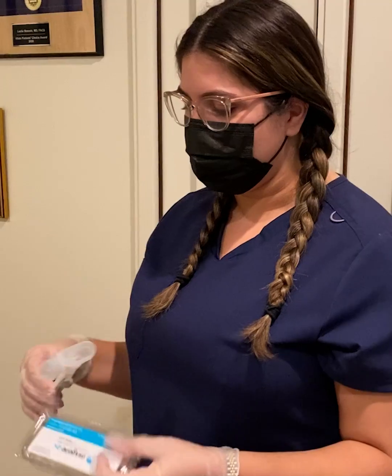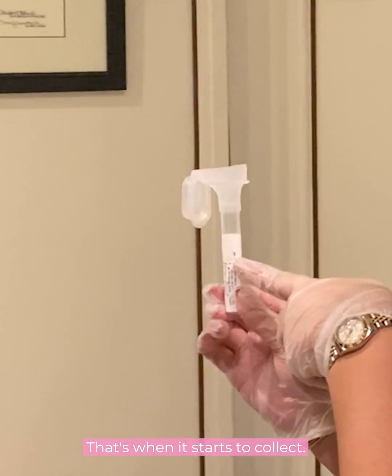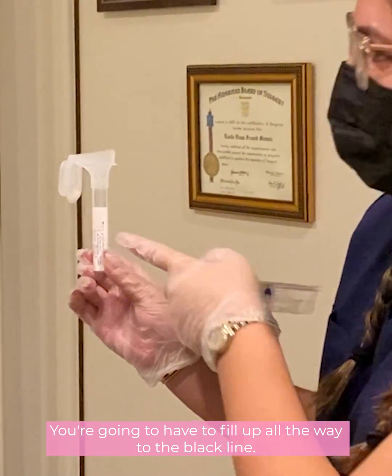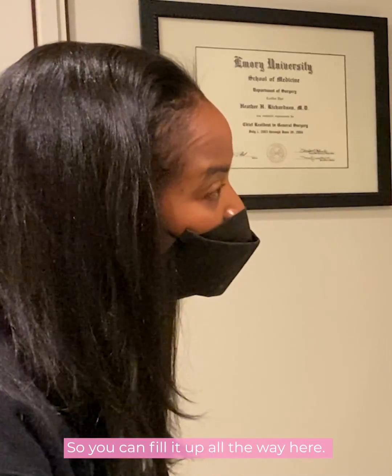No. Perfect. So here is a vial, and you're going to see this white line — that's where the spit starts to collect. You're going to have to fill up all the way to the black line. And the bubbles don't count, so you can fill it up all the way to the top.